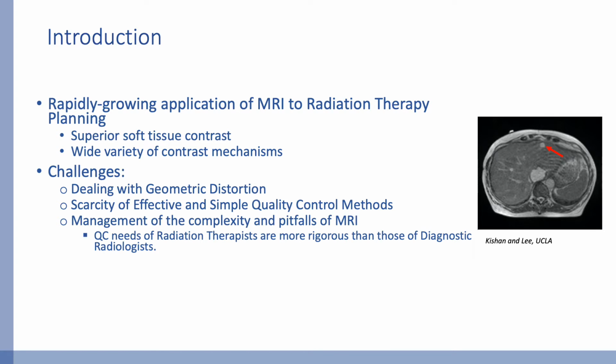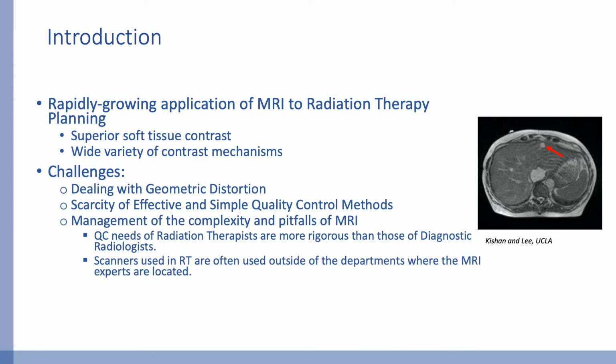The quality control needs of radiation therapists are actually quite a bit more rigorous than those of diagnostic radiologists. Furthermore, the scanners that are used in radiation therapy are often used well outside of the departments where MRI has traditionally been located and where the experts reside.